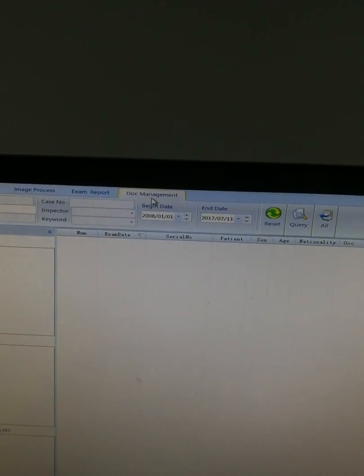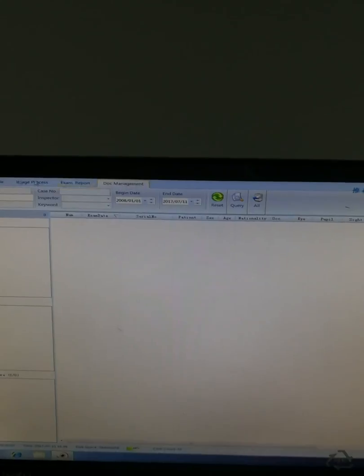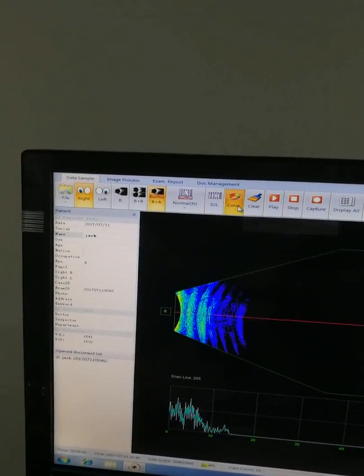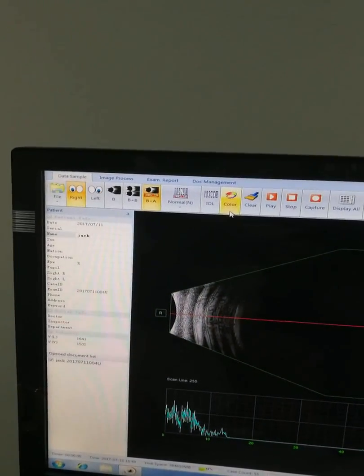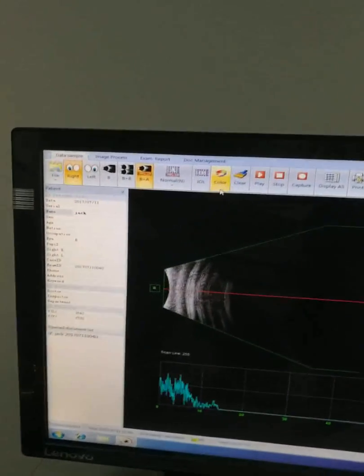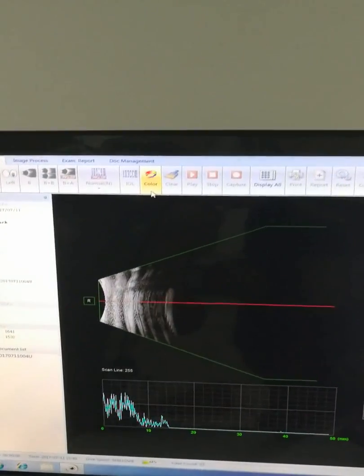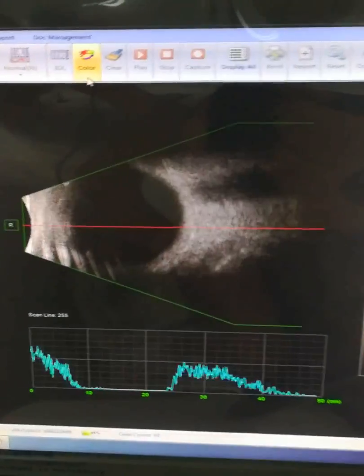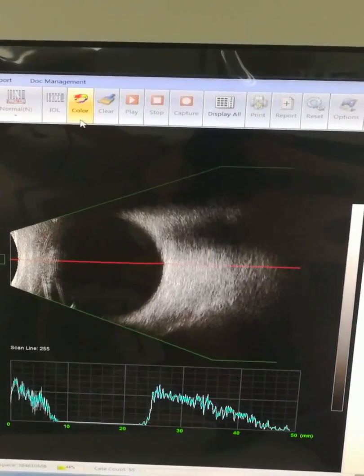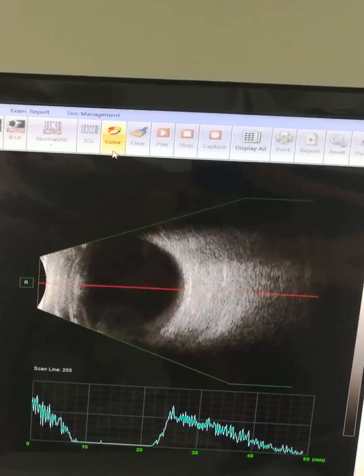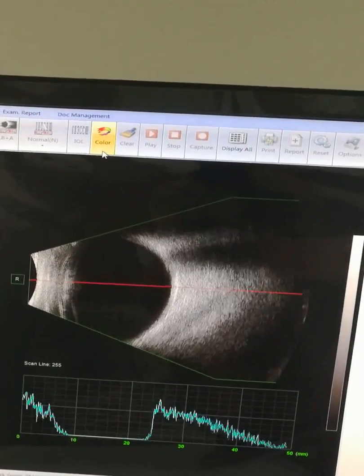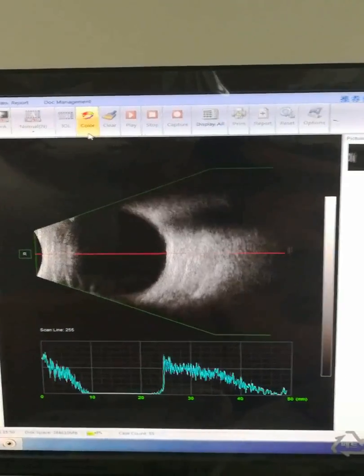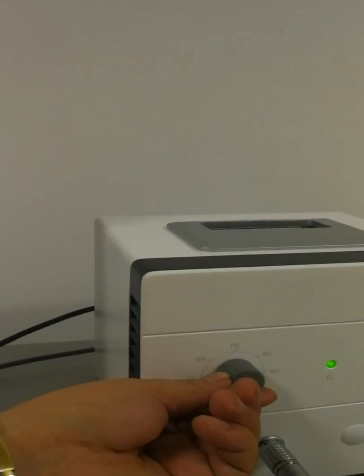Now I'll show you our B image quality. It's now starting to work. You can see the image quality is good. During the test, you can adjust the gain and the brightness.